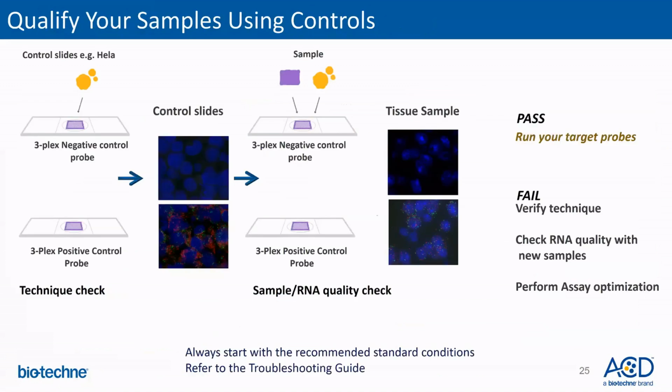On this slide is shown how you can qualify your samples using controls. We strongly recommend that you use control slides and control probes to verify your technique and do the sample and RNA quality check. On the left are shown control slides for HeLa cell pellet.